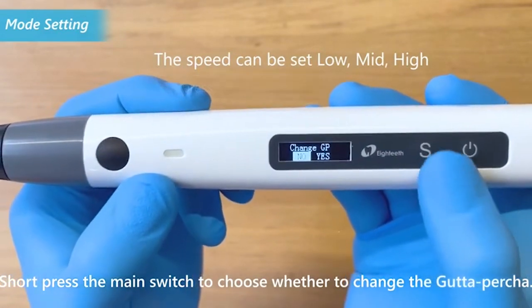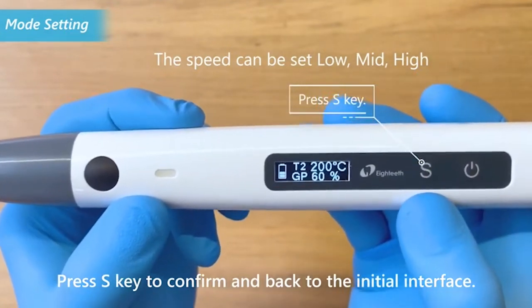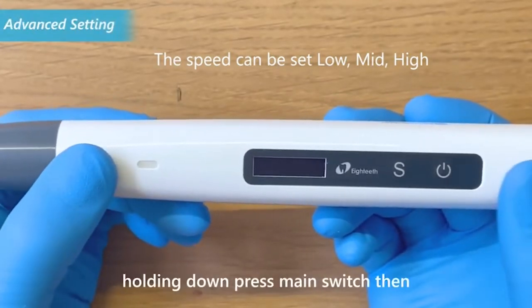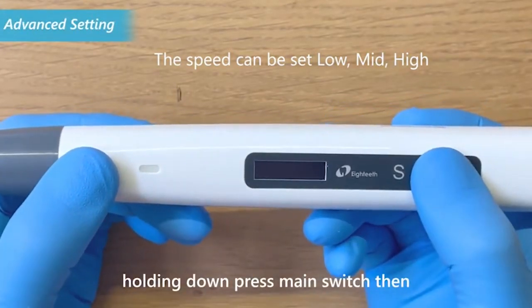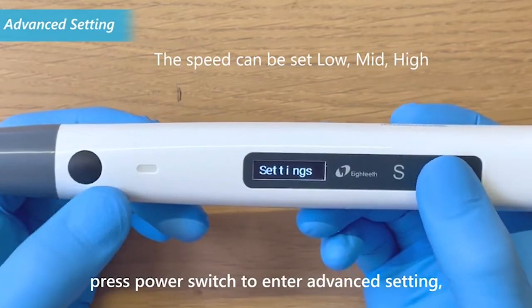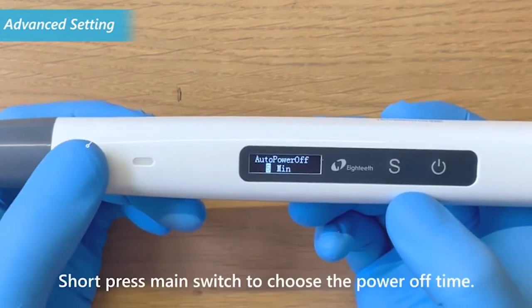Press the S key to confirm and return to the initial interface. During the power-off state, press the power switch to enter advanced settings. The auto power-off option will appear on the display screen. Short press the main switch to choose the power-off time.